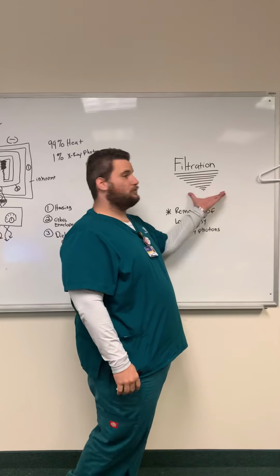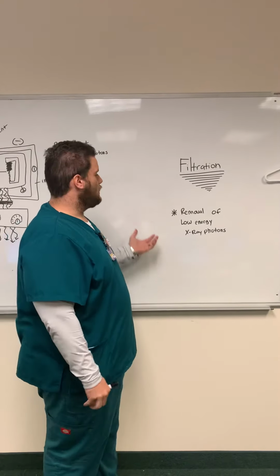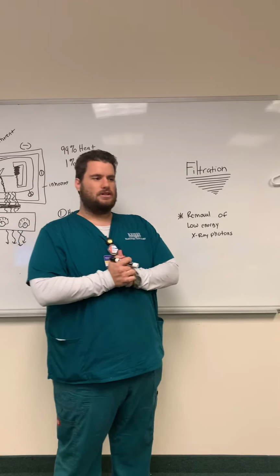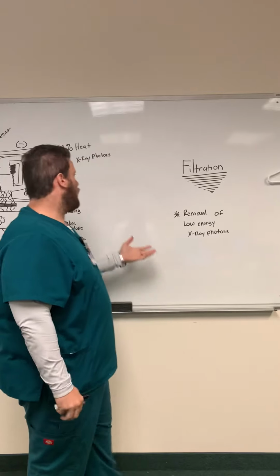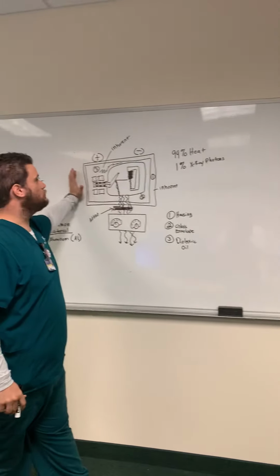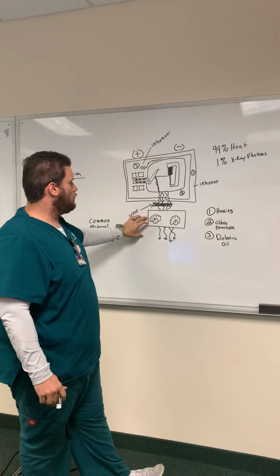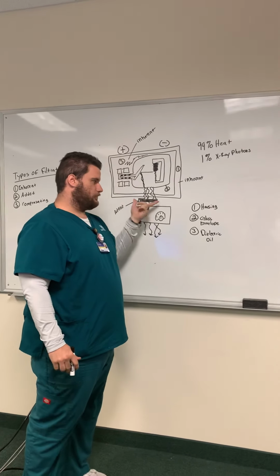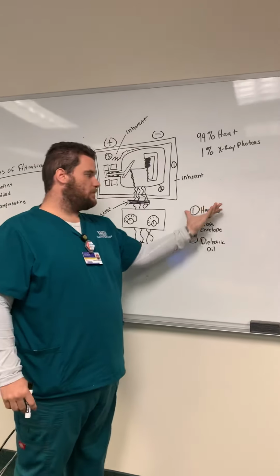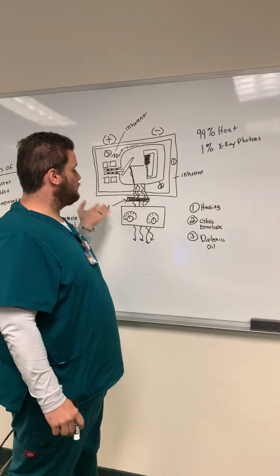I'm here to talk about filtration. Basically, filtration is the removal of low energy photons. Here I have a diagram that shows the X-ray tube, the collimator, and this thin material here, which is a filter. I have them labeled here.